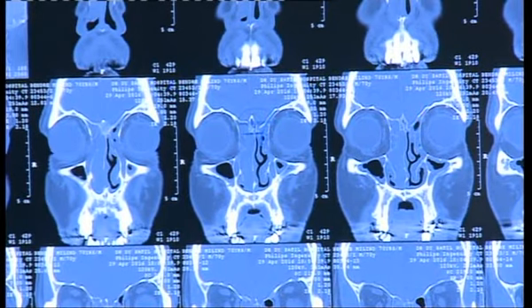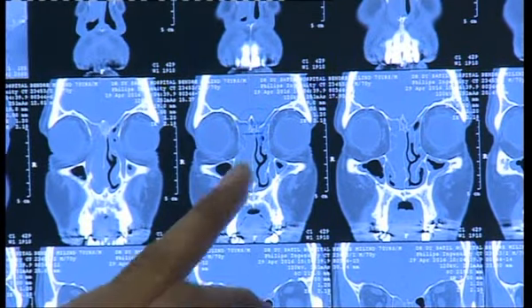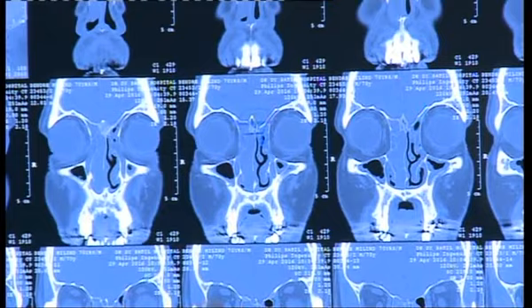It's a very clinical classification. Type 1 Keros means a simpler situation, less likely to give complications from this point of view. Type 3 means the long lateral lamella, you have to be in relation with the long lamella, and you have to be more careful. So that's a clinical classification, and one needs to see in every case what kind of Keros is there, if there is any asymmetry or something.